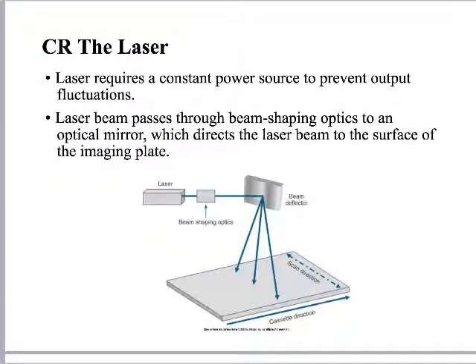Say that again. Yeah. Cassette is moving through the what? So the cassette is moving through the reader, and you can hear the little motors making it go through the reader. And then it's also being scanned by a laser. So if my hand was the cassette, the cassette direction is like this, going through the reader. The laser's going across it like this, reading it as it goes through the reader.